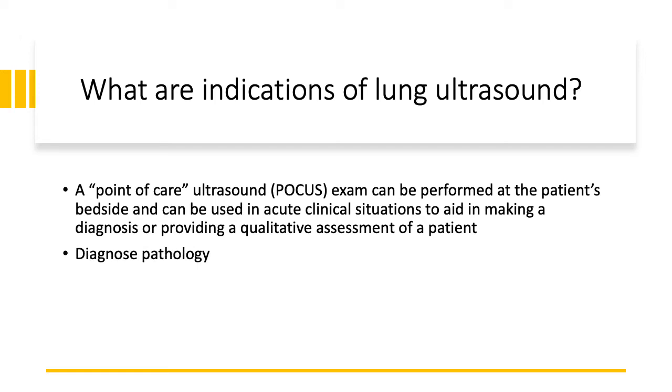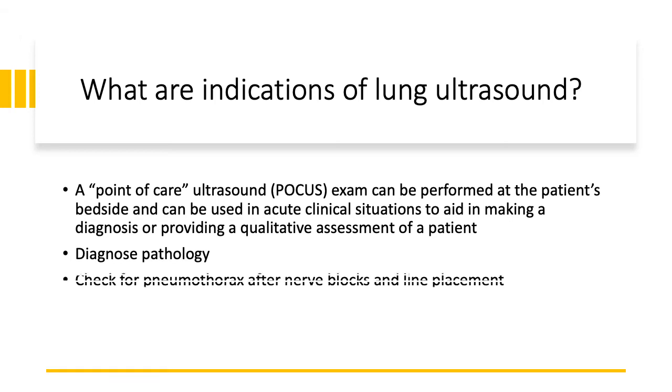It can also be used to diagnose pathology. For anesthesia providers, it can be used to check for pneumothorax after nerve blocks and line placement. And it can also be used to check for diaphragm movement.